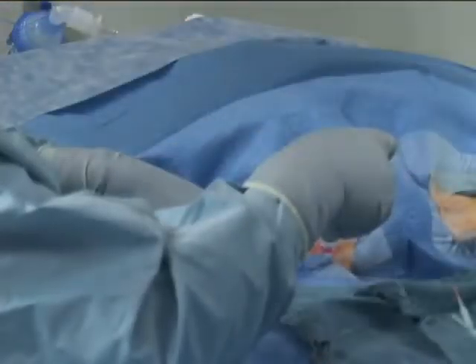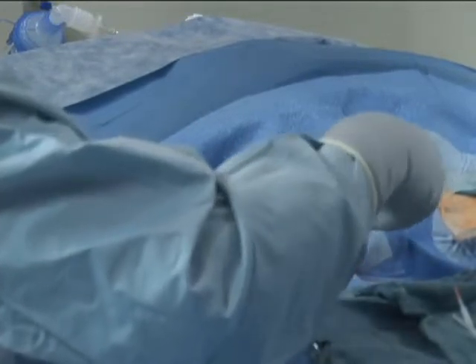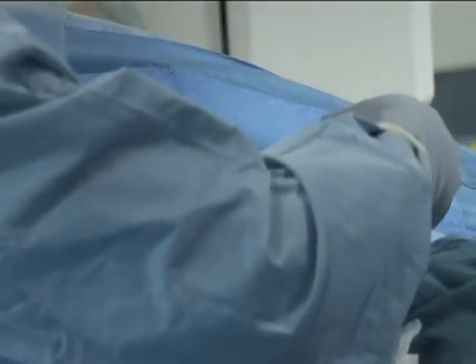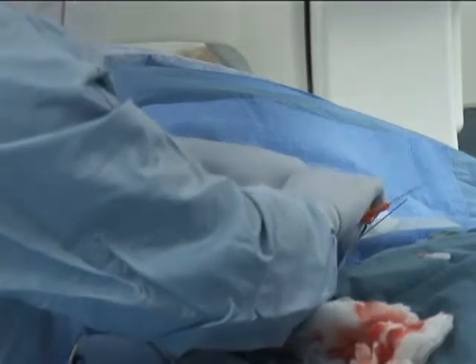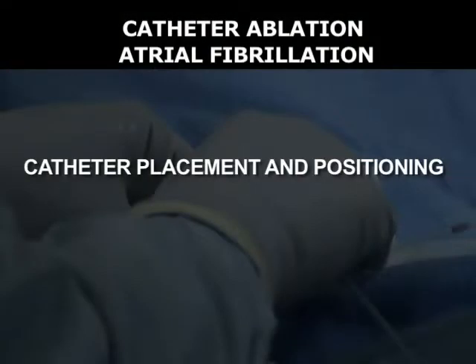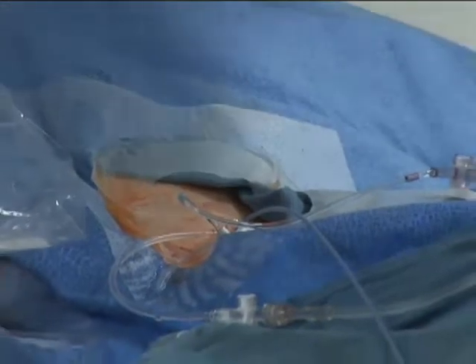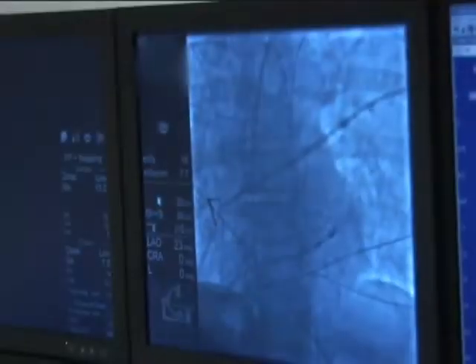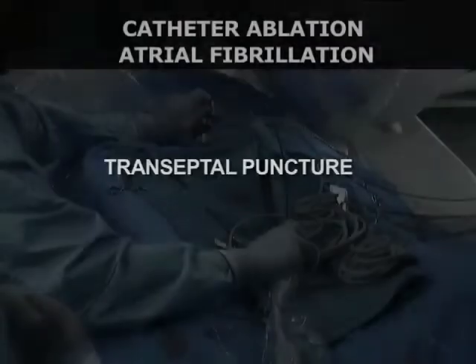A second venous access point is obtained in the femoral vein, about 3 to 5 millimeters away from the first location. Venous access is then similarly obtained in the contralateral femoral vein. After the wires are placed in the veins, the sheaths are inserted over the wires. Once venous access is obtained, the electrophysiology catheters are inserted through the sheaths. Under fluoroscopy, a multipolar catheter is maneuvered into the coronary sinus.